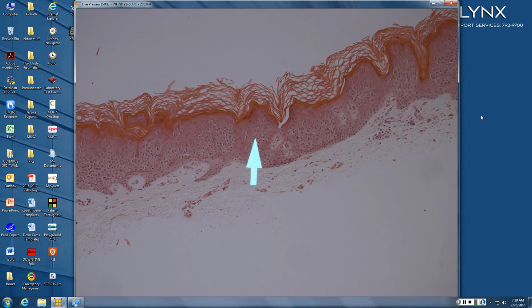So the two are closely related, very similar appearing. And the keratinocytes tend to be smaller than normal epidermal keratinocytes, very uniform. Unlike normal keratinocytes that change and become more squamous towards the surface, these are very uniform throughout, so they don't undergo normal maturation.